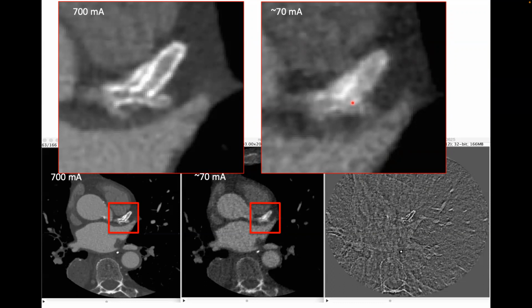Let's say we have a mouse and we put it on a little table, and we have an X-ray source relatively close to the mouse, right? Then we project that X-ray through the mouse and the shadow gets magnified as you move away from the mouse, and then we detect it on a big digital X-ray detector. Okay, and now I rotate the mouse.